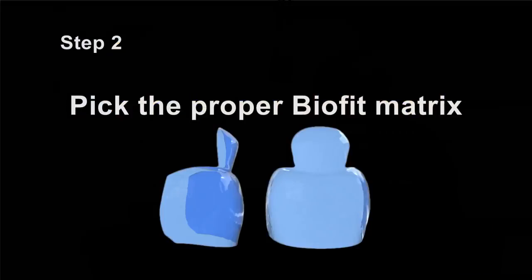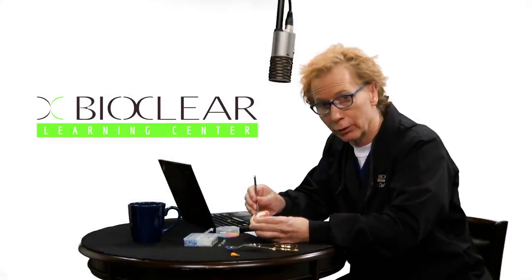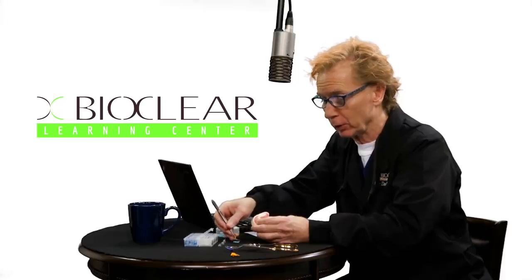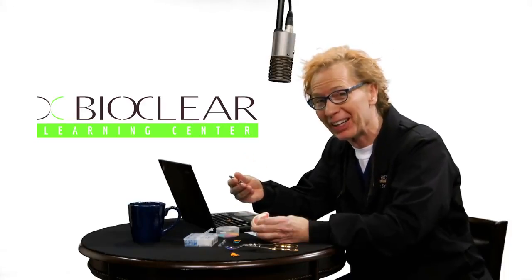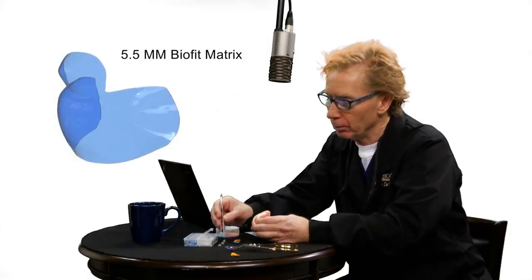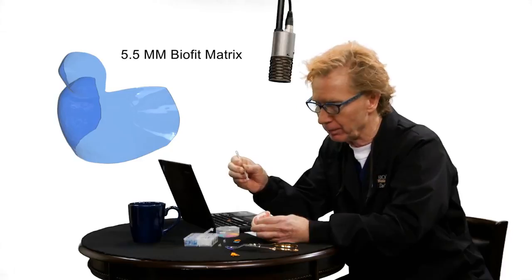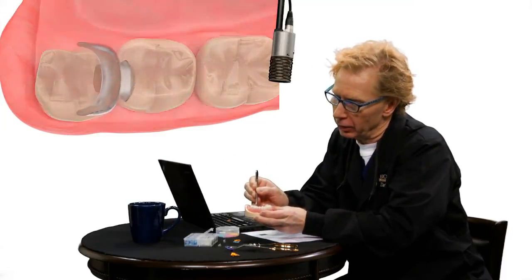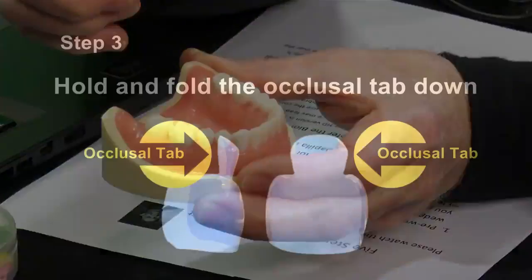Here is a clinical photograph demonstrating pre-wedging in a case where I'm about to retreat a quadrant of failed amalgams and composites. Step two: pick the appropriate BioFit matrix. Once you've cut your cavity preparation, remove the pre-wedge — you'll either be able to reuse it or do progressive wedging and move up to a larger size, since you've compressed the papilla and begun to push the teeth apart. The most commonly used BioFit posterior matrix is the 5.5 millimeter matrix. Slide it in with a slight tilt so it nestles nicely under the tooth.